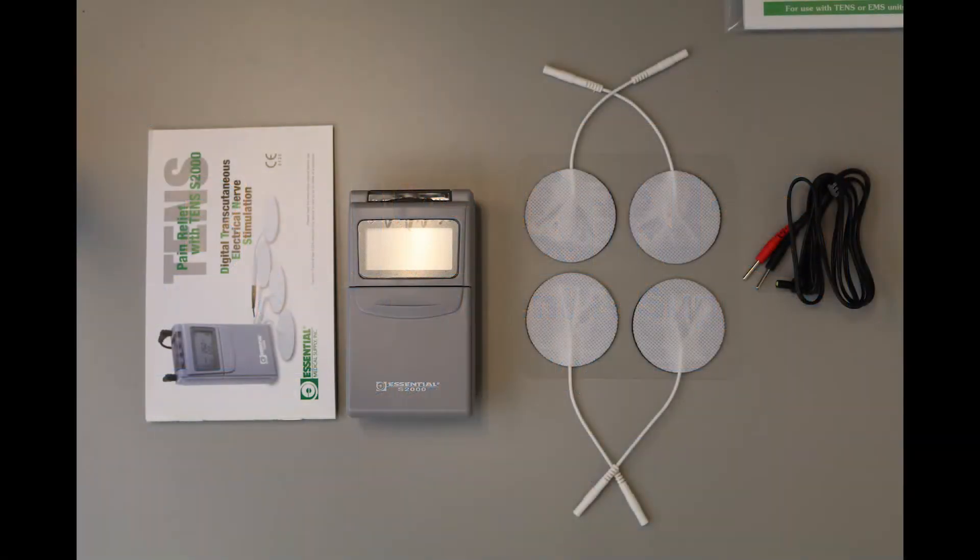Today we will be going over a TENS unit. In this video, we will go over what the TENS unit is, what it does, and how to use it.